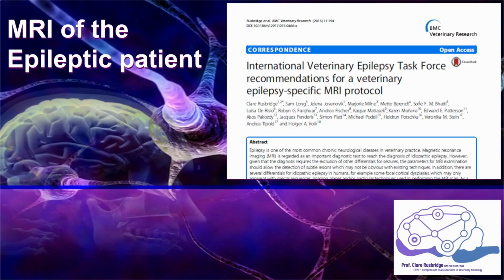So this is the second in a series of 3 lectures on MRI of the epilepsy patient, and in this lecture we're going to talk about an epilepsy-specific MRI protocol and why I recommend that this is done.